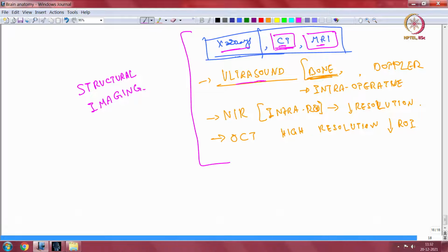CT is the standard for traumatic diseases, you know, somebody has an accident. CT acquisition time is mostly under a minute, so under a minute you can get a CT, and that is very fast to find out life threatening problems. MR takes about 30-40 minutes at the minimum, so it is not a very popular idea. CT is also useful for stroke, in which the golden hour principle exists, and you have to identify and act upon things.